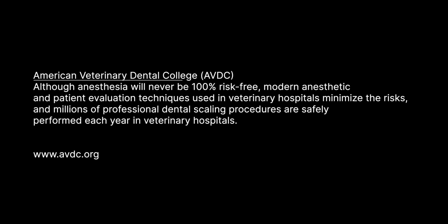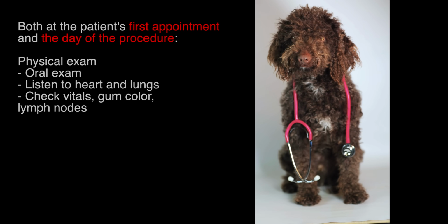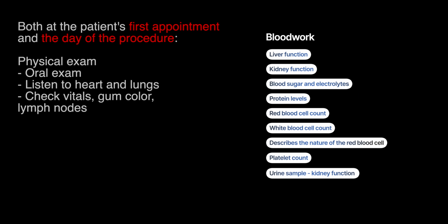Finally, I recognize that anesthesia is not 100% risk-free, but it's not as scary as you think, as long as it's done in an appropriate and conscientious manner, taking the individual patient into account. This includes doing a physical exam, blood work, and monitoring all vital parameters during anesthesia.